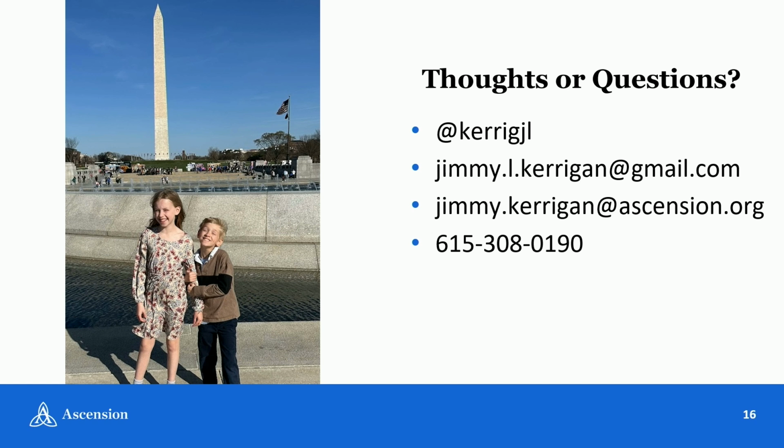Yeah, I think it's very important to know that everything we do with CT, whether it's plaque analysis or FFR or any analysis out there, always requires good image quality. But fortunately, we're in an era now where, due to a lot of work from multiple vendors, we can achieve good image quality on multiple platforms. And you are right that there may be some small differences between scanners, but the differences in plaque are not going to be substantial. It's fairly reproducible, and it's been validated across different platforms. I would actually argue that stenosis severity is going to be more important. If you have a scanner with much higher resolution, in general, the amount of stenosis will be less, and there are papers showing that with photon counting CT, for example, you may downclassify severity of stenosis. So I think your comment is more applicable to severity of stenosis, but when it comes to quantifying plaque, it's actually more stable across different types of scanners.